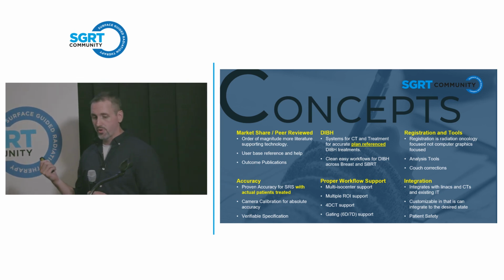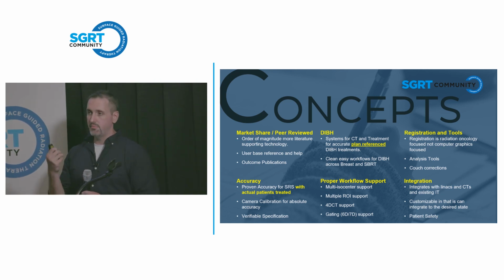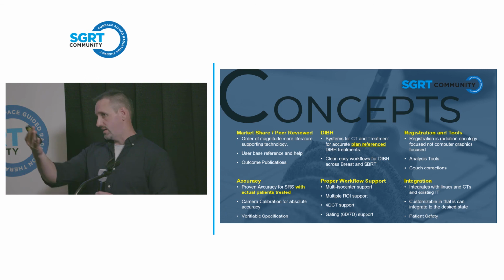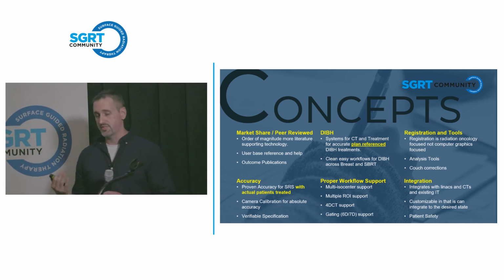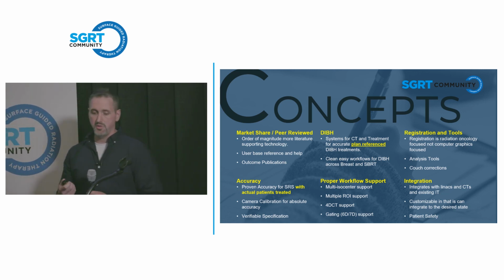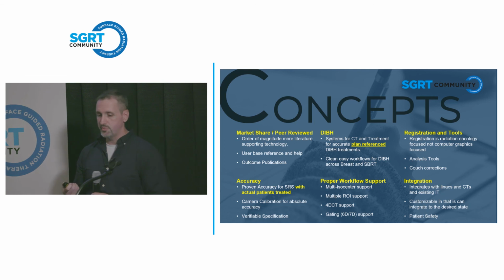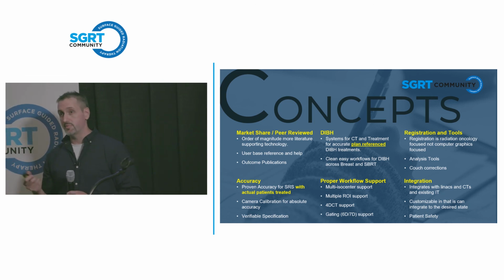And then again, proper workflows. Your systems and your sites have different workflows than my sites, so you really want to look at multiple isocenter support. Phil and I were talking earlier about multiple isocenter breasts versus single isocenter breasts if you have an HDMLC. So you really need to look at that, multiple ROI support, 4D CT support, and gating, whether you're doing gating on all 6 degrees of freedom or 7.